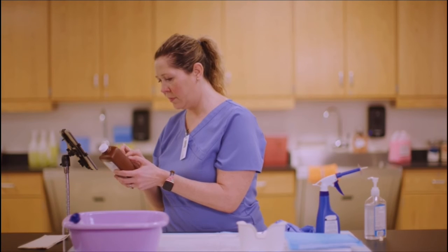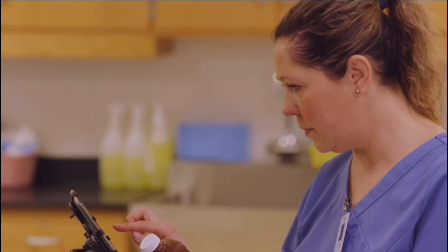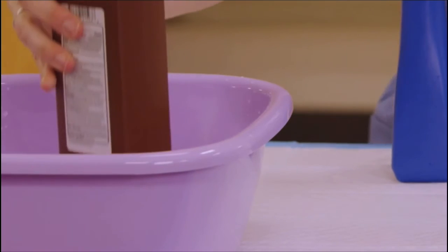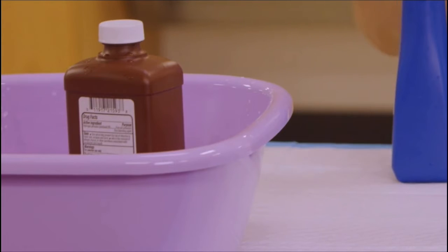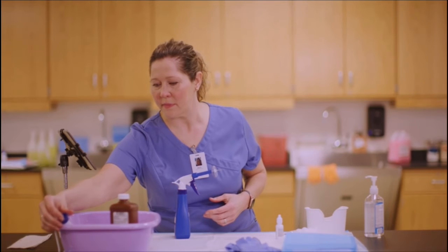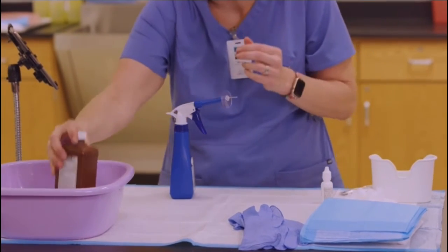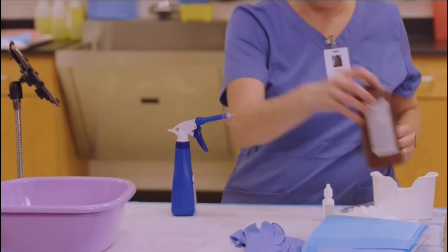Recheck the label of the irrigation solution to the provider's order for a second time, checking the rights that were examined during the first check. Then, submerge the bottle of solution in the basin of warm water, protecting the label, and allow it to sit in the solution a few minutes. Remove the solution from the container of warm water and dry the bottle off.